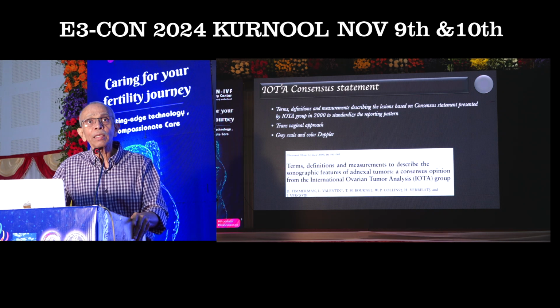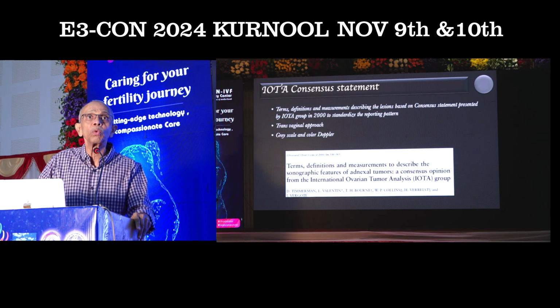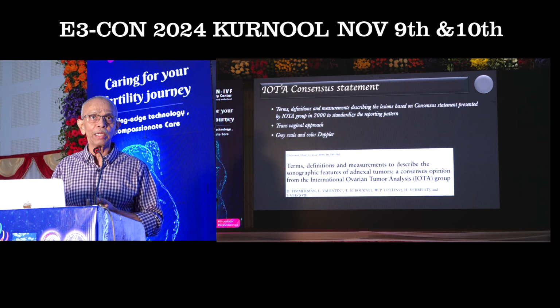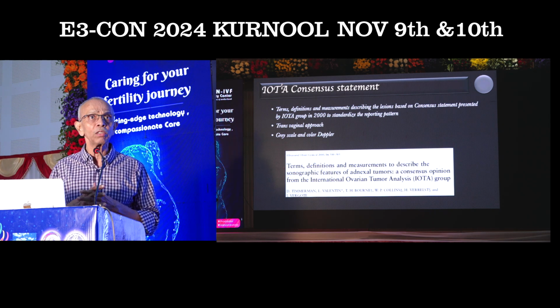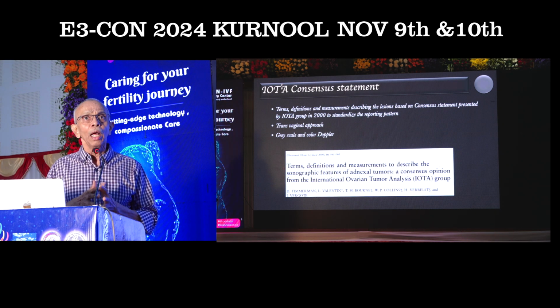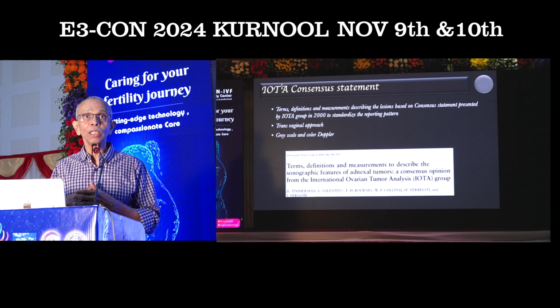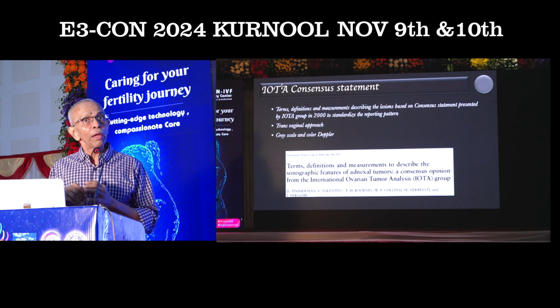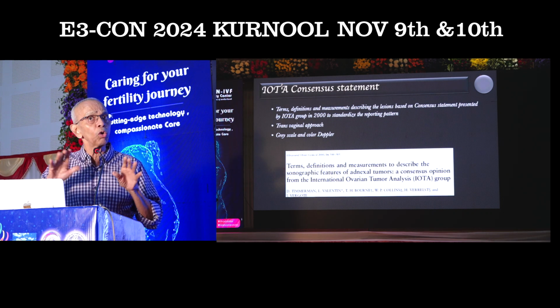The most important factor that they have suggested when we are trying to evaluate an adnexal mass is to evaluate through the transvaginal approach. This is one thing which we have to be very, very clear about. Dr. Gayatri today morning told us about the advantages and disadvantages of both transvaginal and transabdominal. Except for lesions which are very big, wherein you cannot evaluate them transvaginally because of the limitations as far as the depth is concerned, I would prefer to do transvaginal for every lady who comes for a pelvic scan. There is no compromise in it.